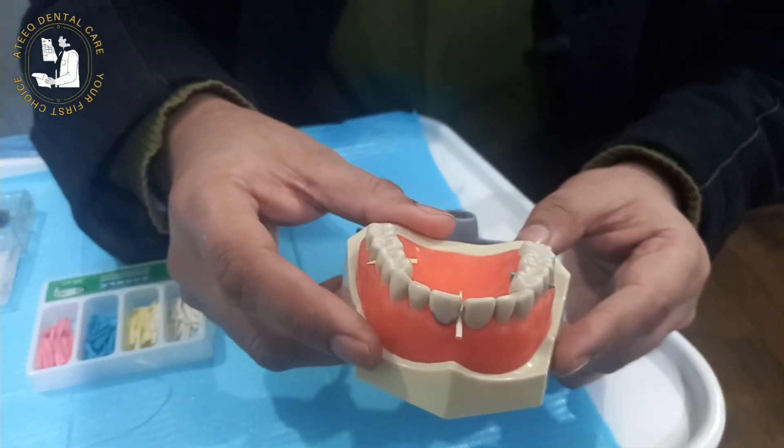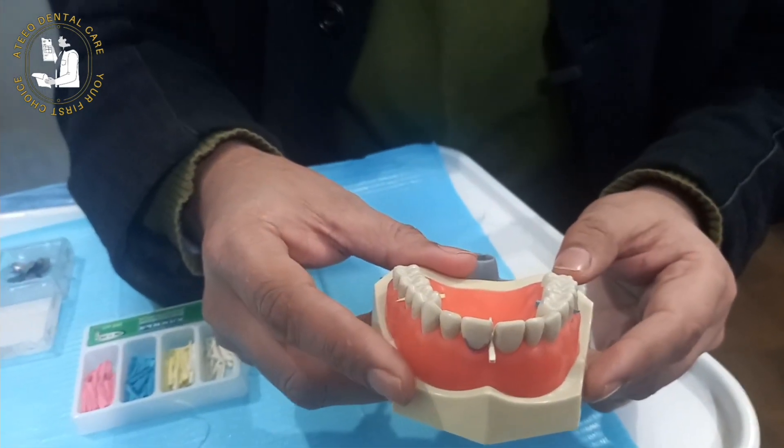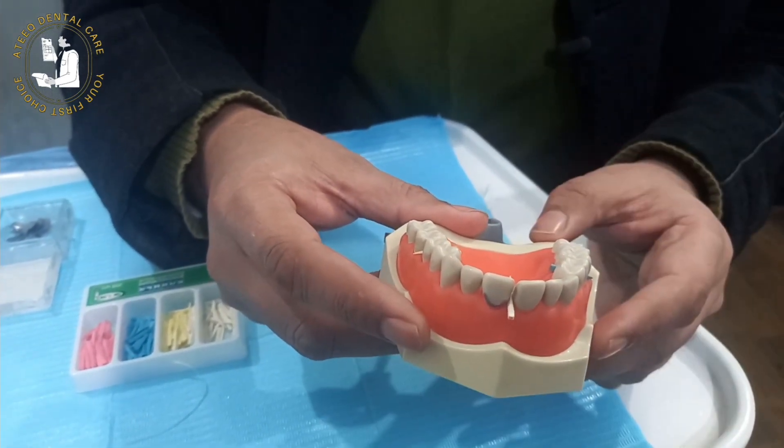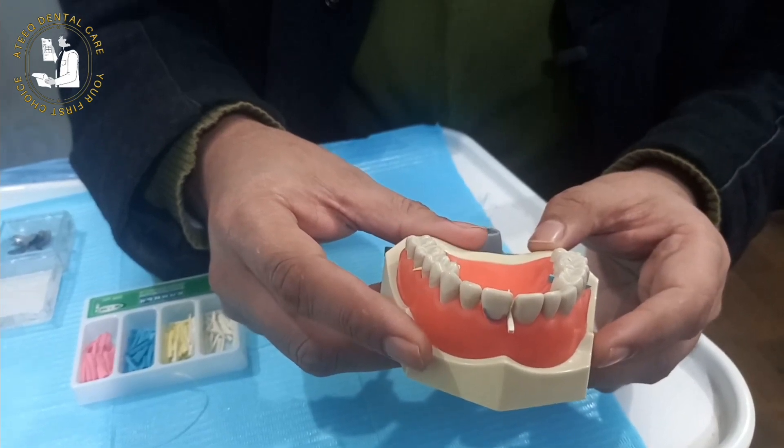There are also other functions of pre-wedging, like separation of the tooth and achieving tight contacts after we place the restoration.